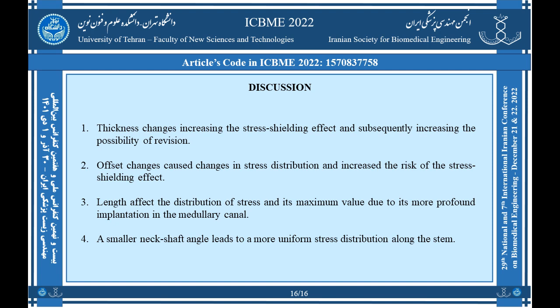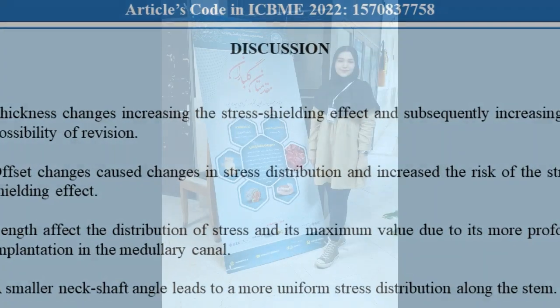However, the patient's physical properties such as bone size, gender, and age can determine the value of these parameters. Therefore, it's imperative to plan before surgery to check and choose the right implant according to the patient's physical properties, because choosing an implant with the correct dimensions for the patient is very effective in the treatment package, and it reduces the possibility of resurgery and revision.